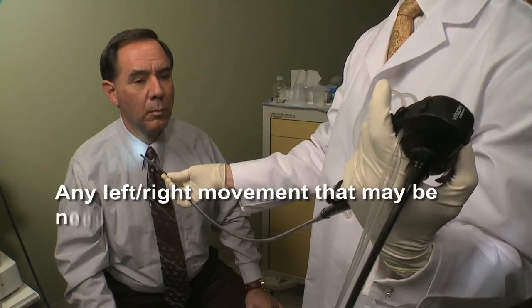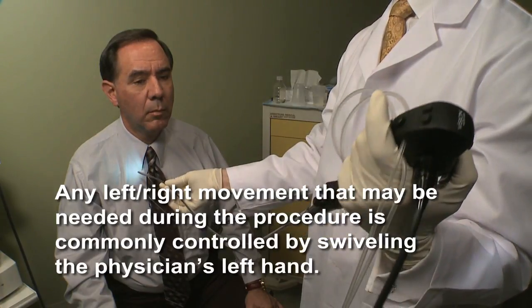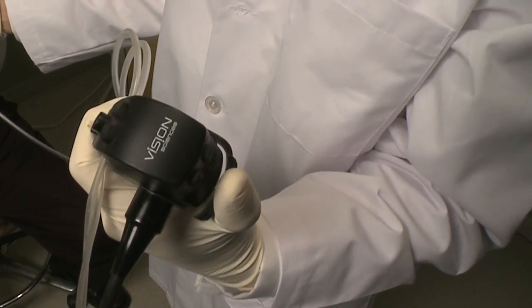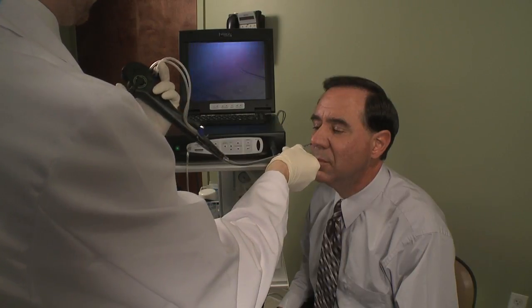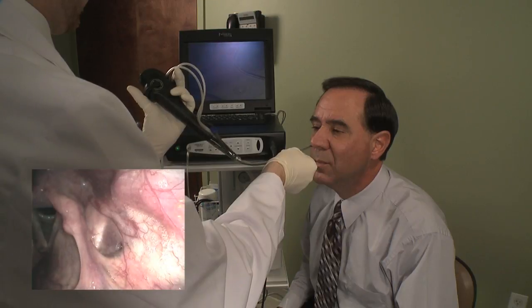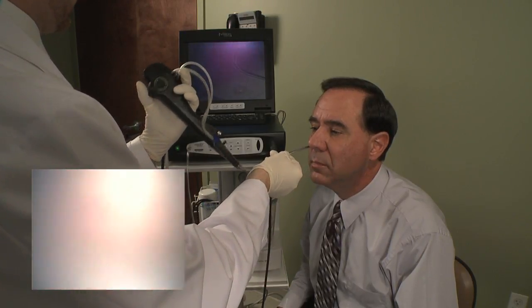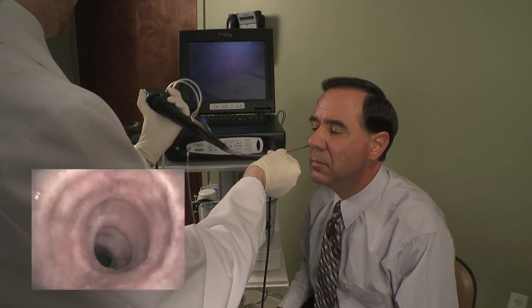Left-right movement can be achieved by gently rotating the control body with the left hand and deflecting the angulation lever when needed. You will then visualize the epiglottis and vocal cords. Continue to slowly advance the endoscope, taking precaution to avoid hitting the epiglottis or vocal cords with the endoscope, as doing so may cause patient discomfort.